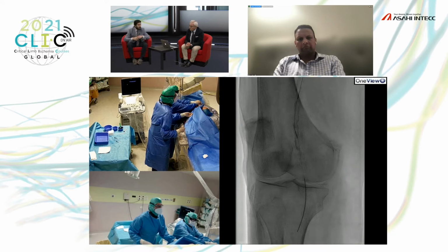I'm not completely sure, but following the video it seems that in some way the tip of the guide wire elongates a little bit. Does it happen or not? I'm not sure about this coil.